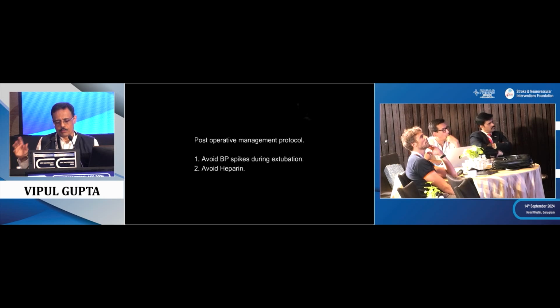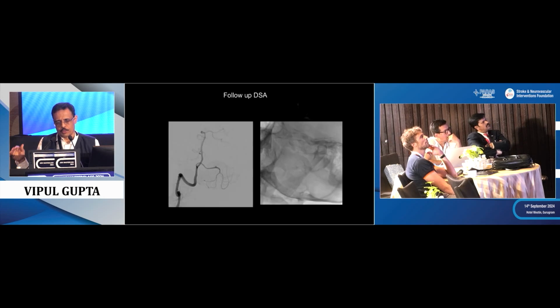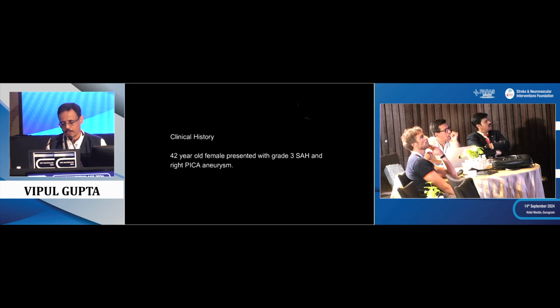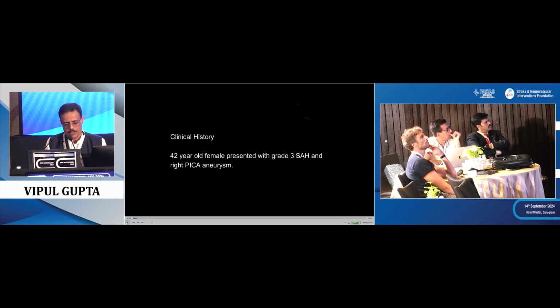As I said, no heparin post-op. We reversed the heparin, kept low blood pressure on extubation. And this is the 3-month follow-up. Most of the aneurysm is gone, well preserved. In this case, no stenosis of the artery or anything. So we've done well. So yes, let me start from there.